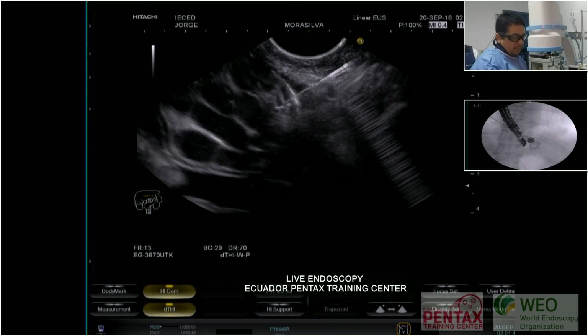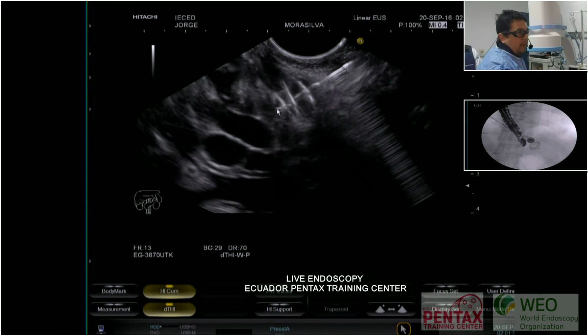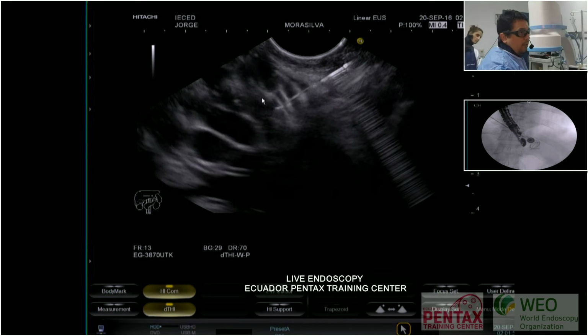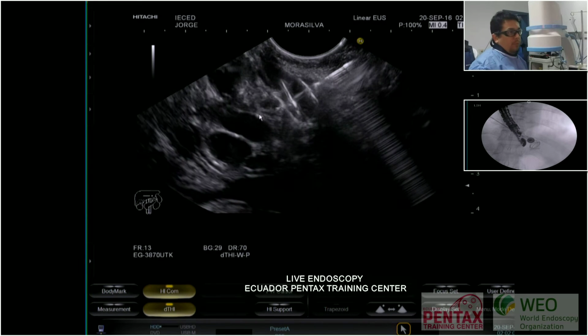So here you have the coil, the first coil, but this is only one coil. We need more coil, at least two more coils to complete or occlude the vessel, okay? So we will put another coil, please.